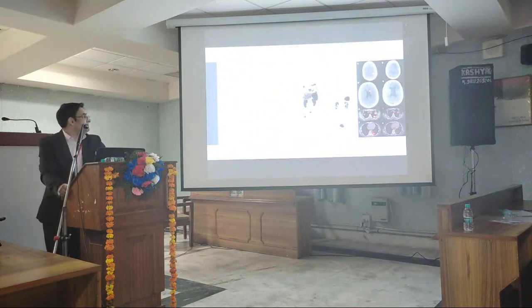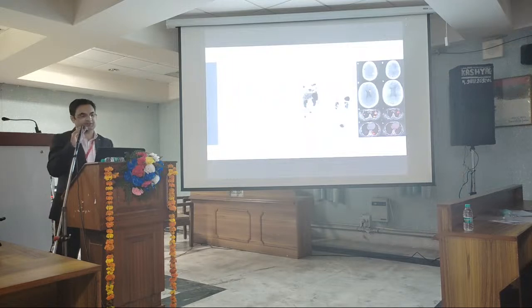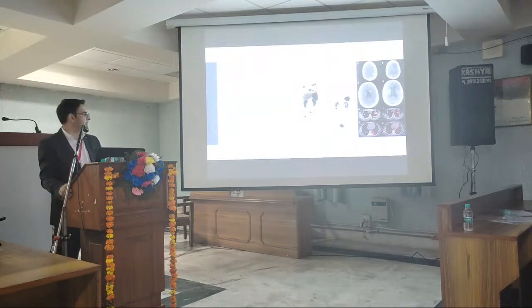Second, if there is metastatic, unresectable disease, you can try PRRT therapy, which can be labeled with lutetium-177, and then, if unresponsive, targeted alpha therapy can be used. This is the example of the baseline PET-CT gallium DOTATATE, and this is after the alpha therapy. This study was conducted in England and officially published in the European Journal of Nuclear Medicine, which shows that the bright spots, which are the metastatic disease, completely vanished after the alpha therapy.